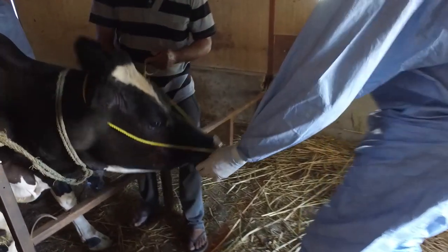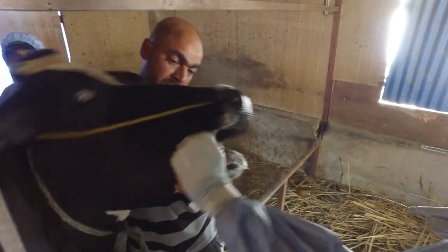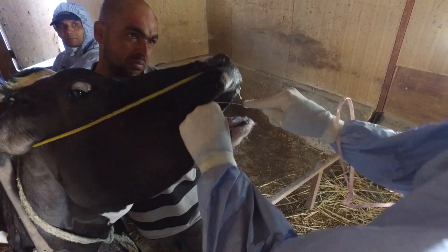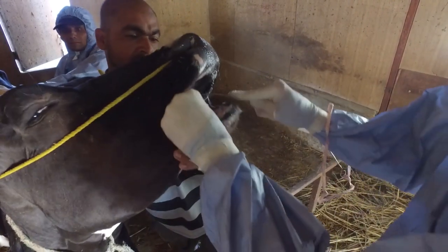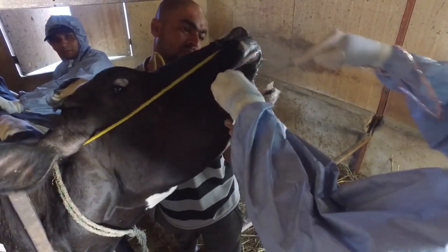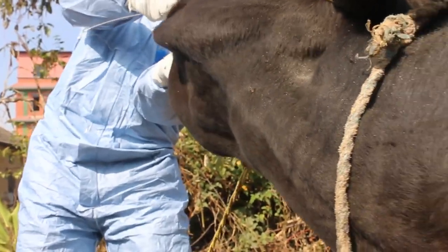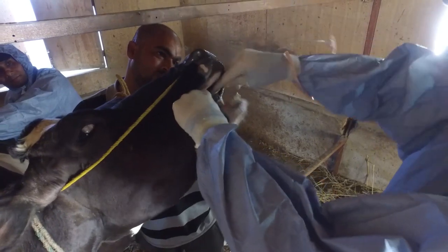Introduce the probang centrally in the mouth to avoid the animal chewing on the cup. Swiftly push it to the back of the mouth where it will be obstructed by the larynx until swallowed. Once past the larynx, the probang cup moves readily within the upper oesophagus. Its passage there is often visible externally if the upper neck is viewed from the left side. To collect the sample, the probang is moved backwards and forwards five to ten times at the top of the oesophagus and the back of the oropharynx.